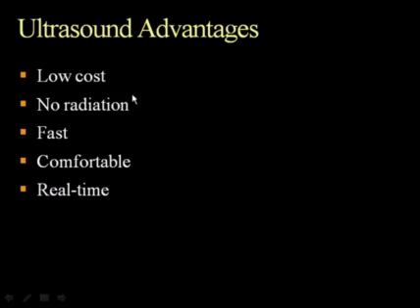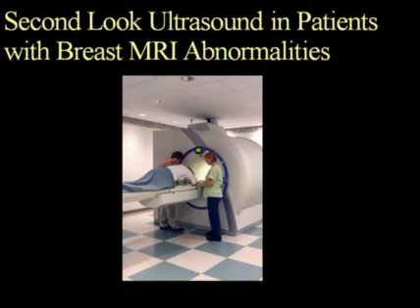Ultrasound advantages are many. The low cost, no radiation, it's fast, it's comfortable to the patient. They're lying supine as opposed to in an uncomfortable position for other testing that we do. And it's real time. You're actually seeing abnormalities, or you're correlating with what you're feeling. You're palpating the area, you're finding a cyst, you're able to do real time, on-time correlation.